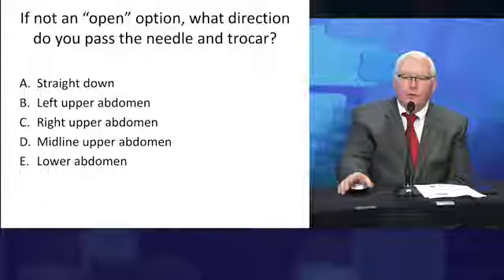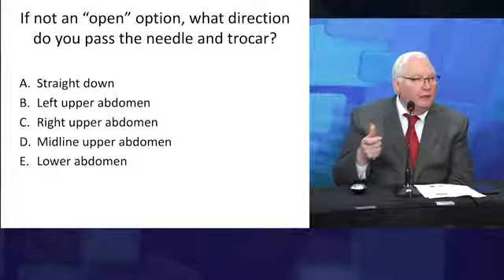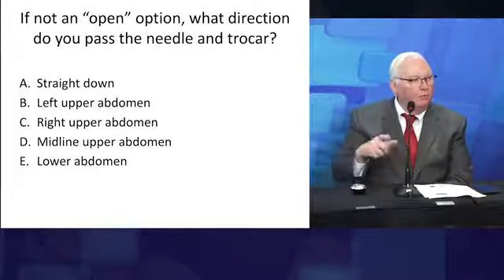So this question was, when it's time to pass your needle in your trocar, do you pay attention to the direction it's going? Do you try to go in and up toward the spleen, in and up toward the right, in and up toward the left, straight up, or do you go straight down? I go up. I lift up on the umbilical stalk and then I poke superiorly. Superiorly in what direction, left or right? Superiorly, straight up. Ooh, that's the wrong answer. I know what you're getting at, but I still do that.